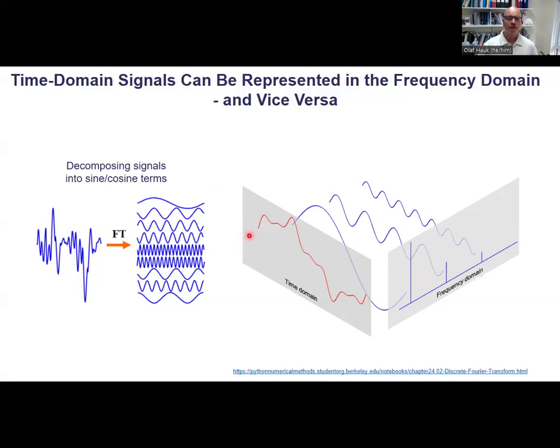What we are trying to achieve is that we decompose a time domain signal into its multiple frequency components. So let's just imagine that this signal could be approximated by a very slow sine wave already. A lot of variance could be explained by the slow wave. And then in order to explain even more, you have to add other frequencies as well at certain phases. And the amplitude of these different contributions from different sines or cosines is represented as peaks with different height in the frequency domain.